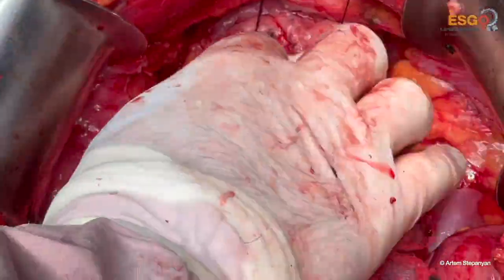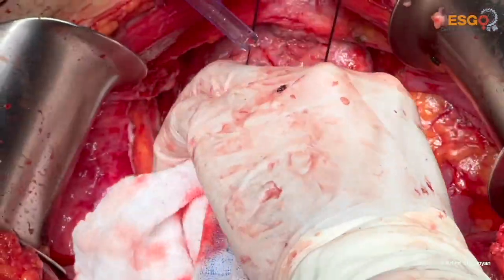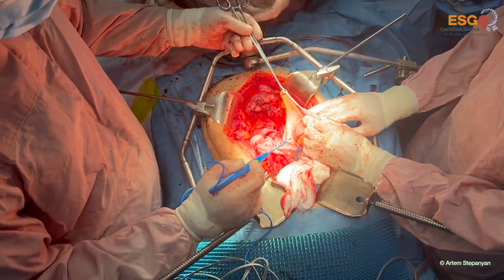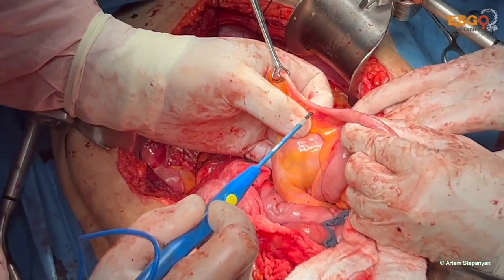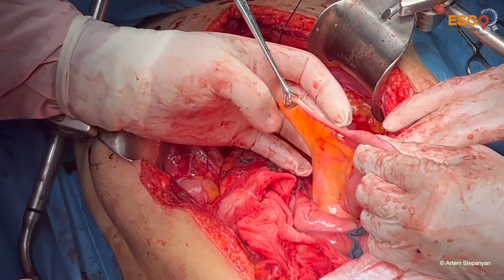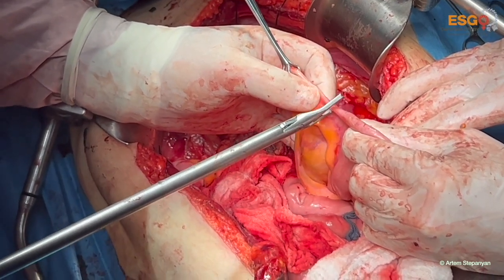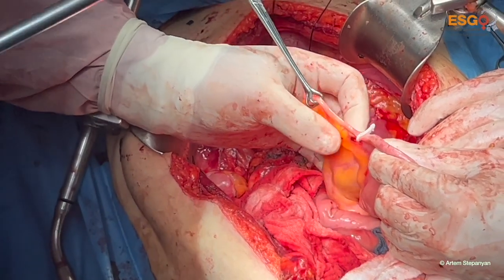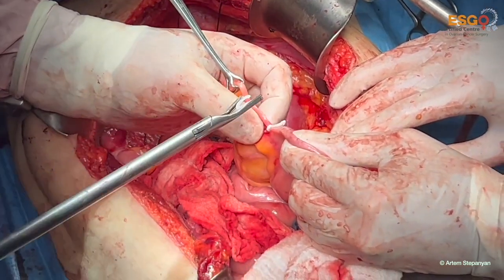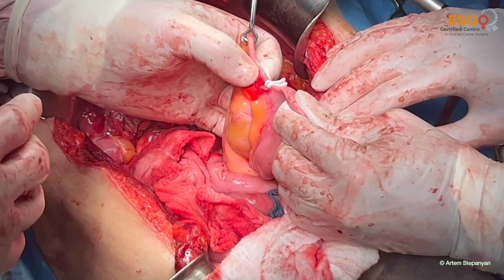Okay, here we see that the whole macroscopic disease is resected. There might be some small residuals which will be removed separately. Now we check for any additional disease, we'll find some disease on the appendix. The appendix is removed also. It's doubly clipped and removed by a ligature.